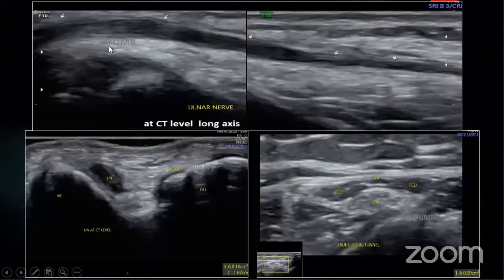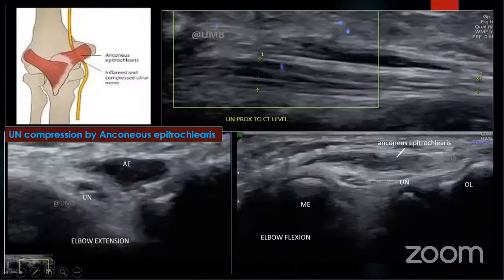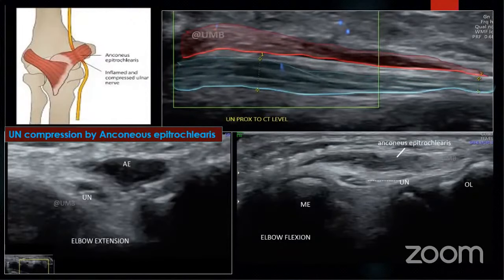Here you can see a thick ulnar nerve passing across the cubital tunnel, and at the level of the true tunnel the nerve is getting normal. Sometimes we may have an accessory anconeus epitrochleus muscle there, joining the olecranon process to the medial epicondyle, and it replaces the Osborne retinaculum. But mind it, a muscle will never cause compression unless it is hypertrophic, because it is a softer structure than a ligament. Here you can see the muscle overlaying the thick ulnar nerve.